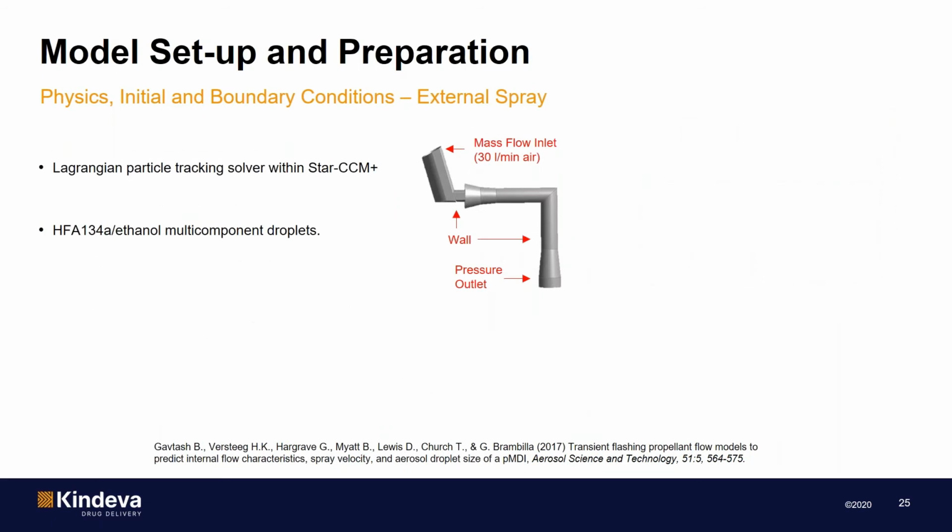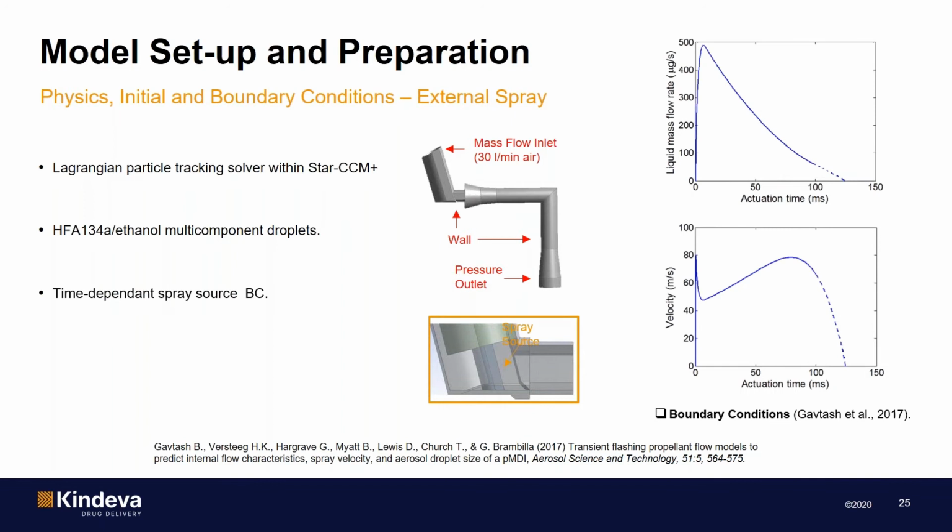Moving on, in our external spray model, we've assumed that the air is entering the pMDI at 30 liters per minute and exits the outlet of the induction port at atmospheric pressure again. Now, for this type of modeling, we use Lagrangian particle tracking to simulate the spray dynamics. The droplets are defined as a multi-component HFA ethanol mixture, and the spray source is constructed with time-dependent velocity and mass flow rate boundary conditions, which again are calculated by a separate model.